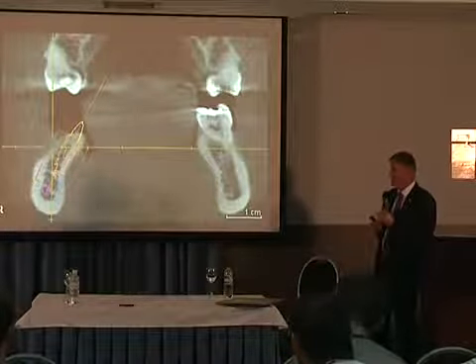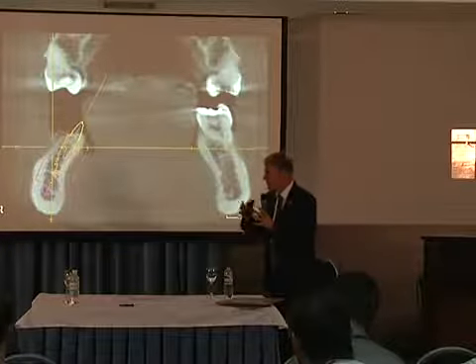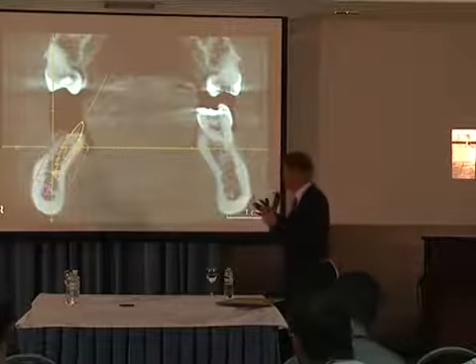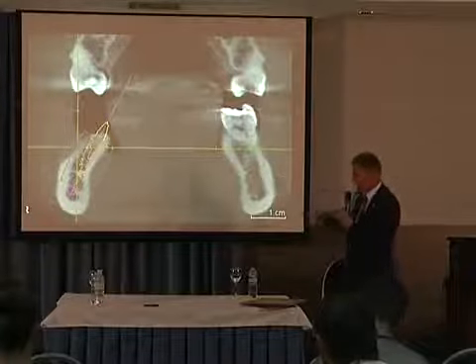But now this technique of tissue-friendly piezoelectric surgery, soft tissue management and tissue engineering helps us to do this one stage with the splitting.